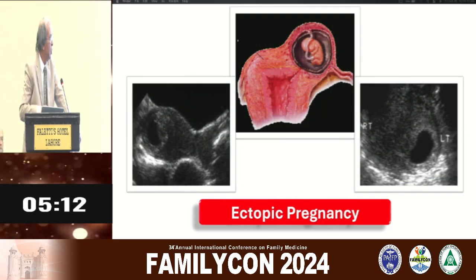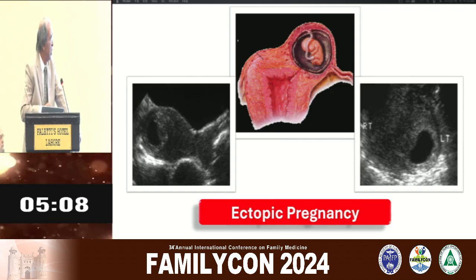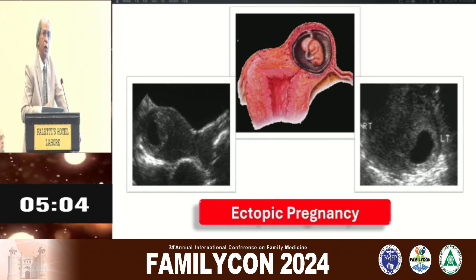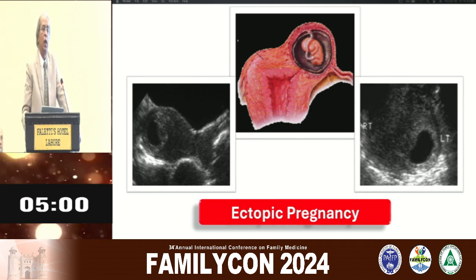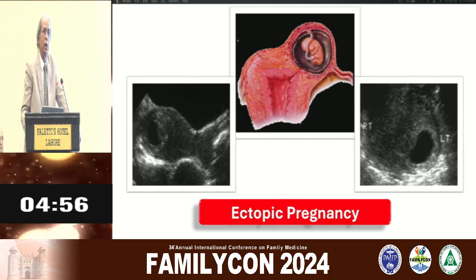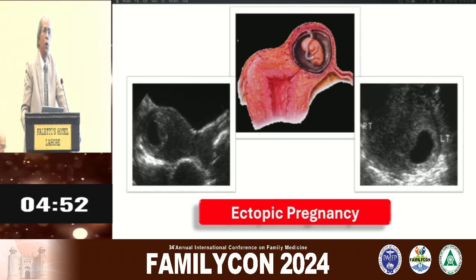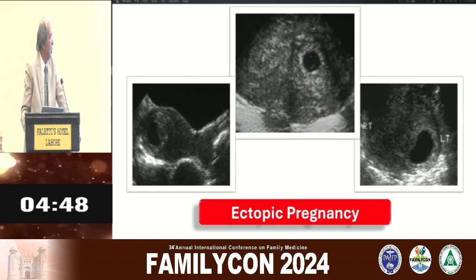Interstitial, Dr. Manzoor Sahab has already told, the myometrium-endometrium distance should be at least 5 millimeters. A 5 millimeter ring of myometrium is not present, and we should be very careful in diagnosing this pregnancy because this ectopic is catastrophic for the life. A lot of hemorrhage occurs because of the dual supply.